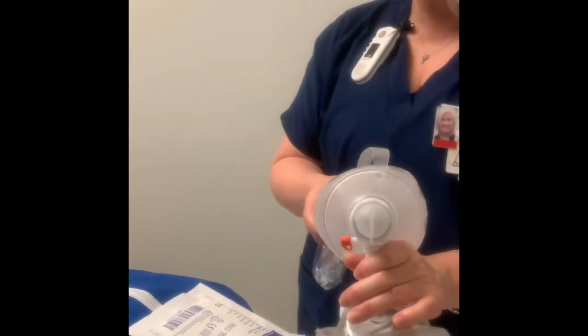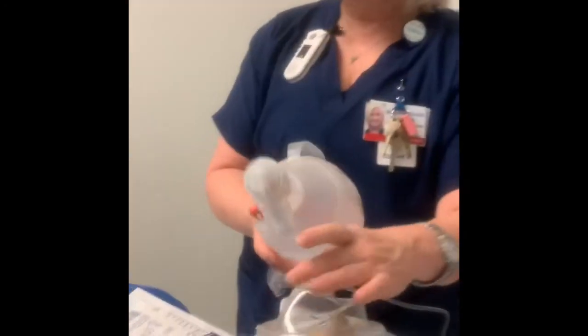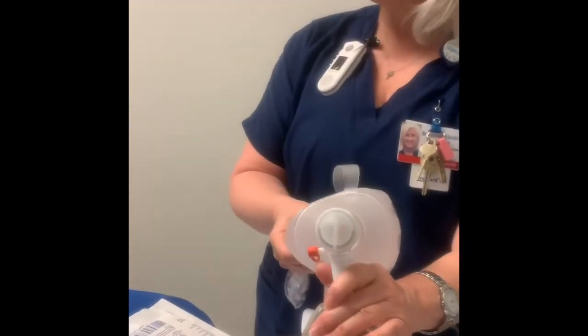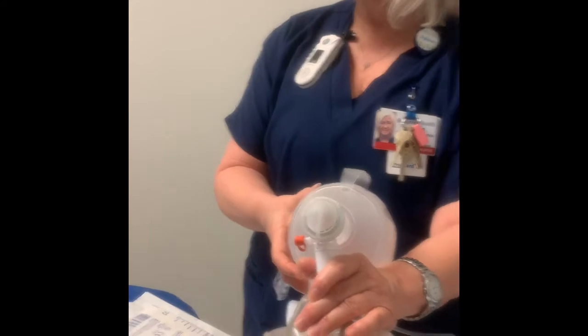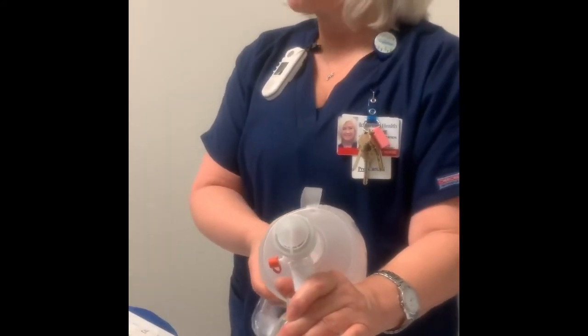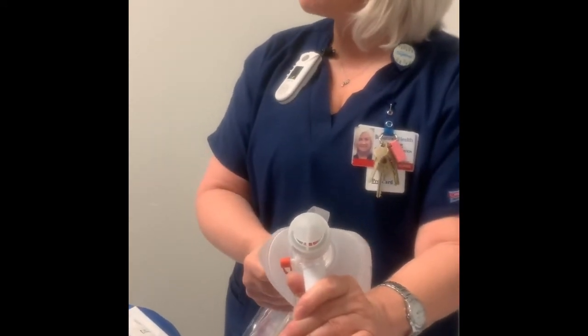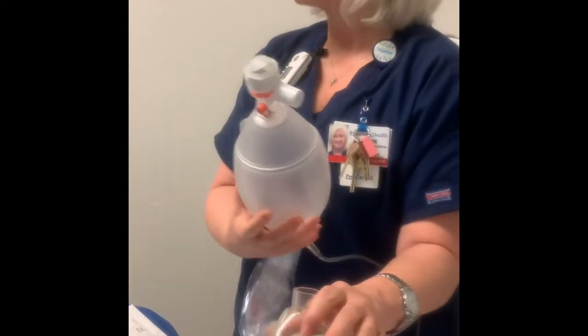Okay, then you're gonna ventilate them here. Then adult ambu bag and an adult mask. Does that make sense? This is only if they're not breathing. You still pretty much want to do it anyway, so just cover it here. Okay, you can ventilate them. But watch their SATs too. They may not always need it.